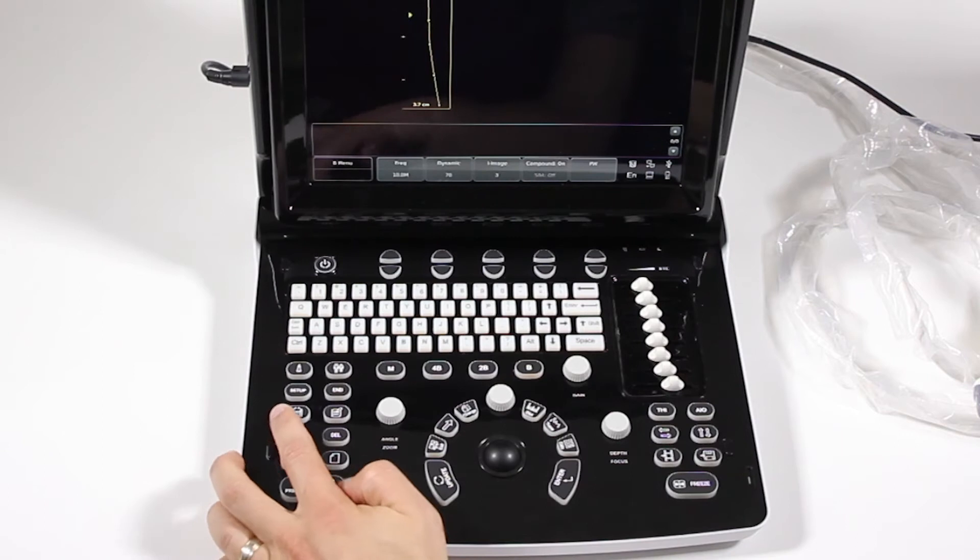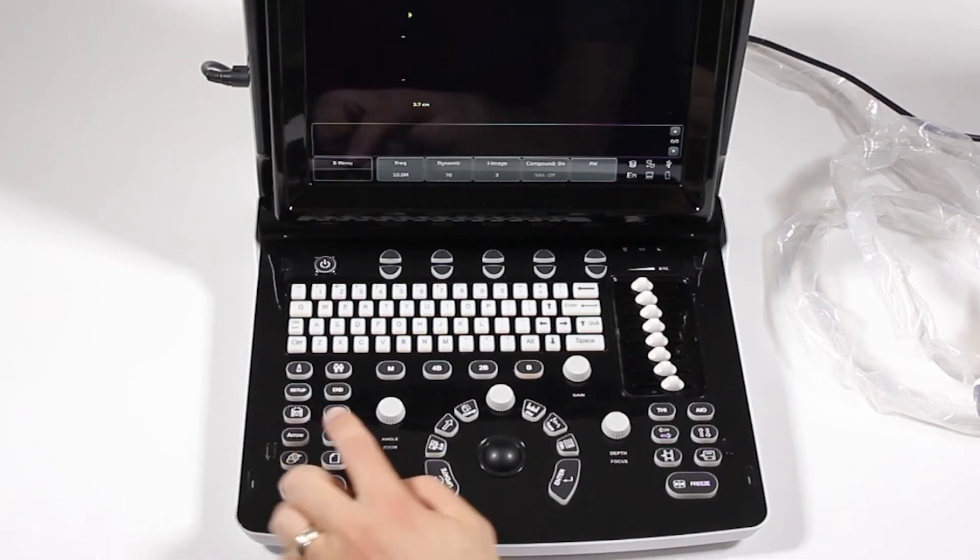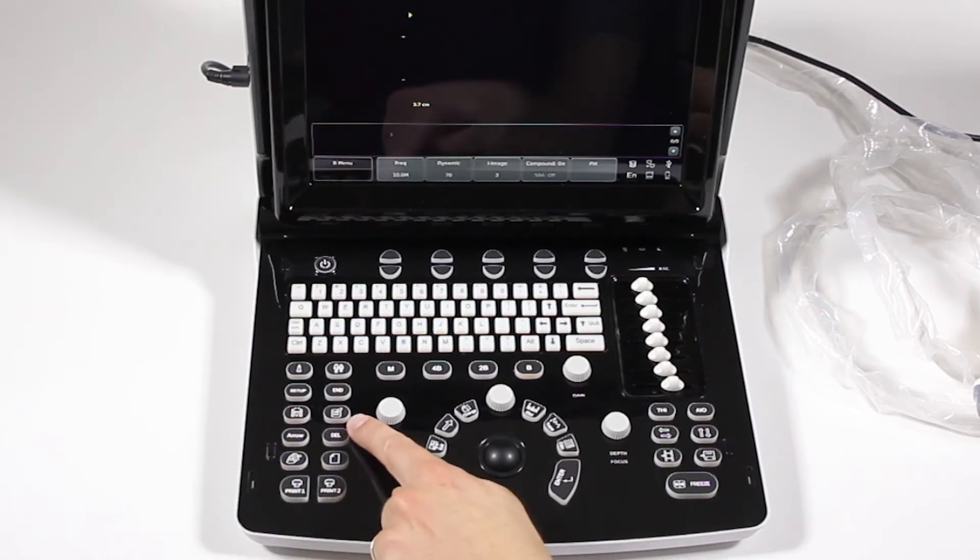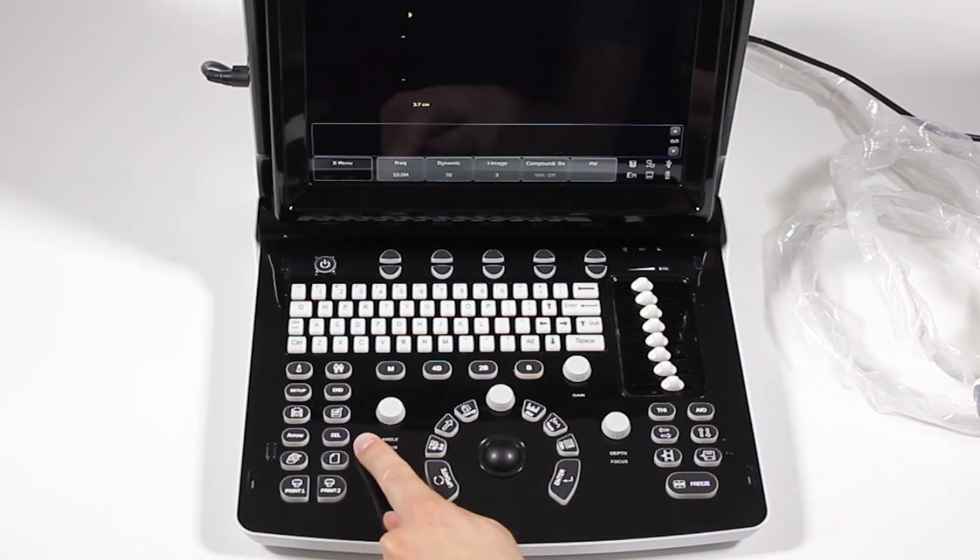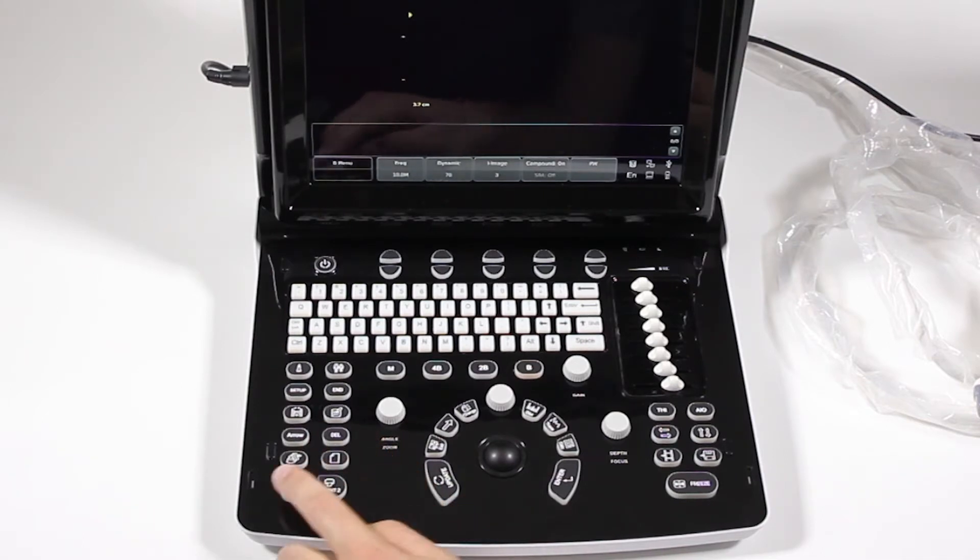End is for end exam. We have a body marker. We have a comments button, an arrow for putting an arrow on screen, delete for deleting comments and measurements.